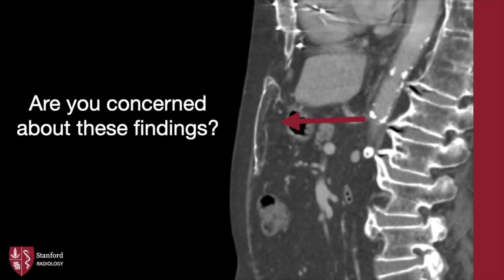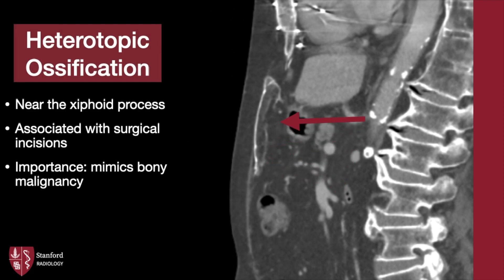For our companion case, are you concerned about these findings? In the region of the xiphoid process again, there is a well-corticated ossification. Unlike the last case, however, there is no osseous or chondroid matrix. This is heterotopic ossification — it's commonly seen near the xiphoid process, especially after surgical incisions. Note the median sternotomy wires here. Abdominal surgeries can also be associated, as the rectus abdominis muscles attach to the xiphoid process.